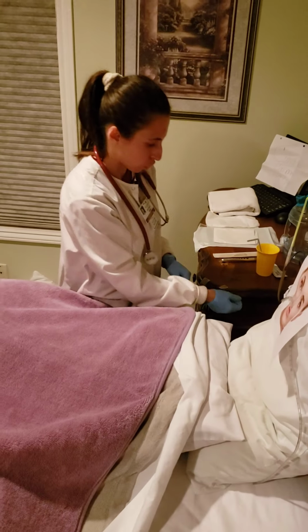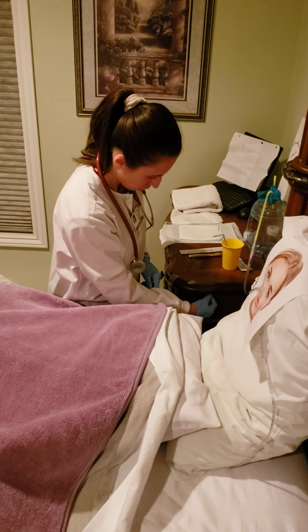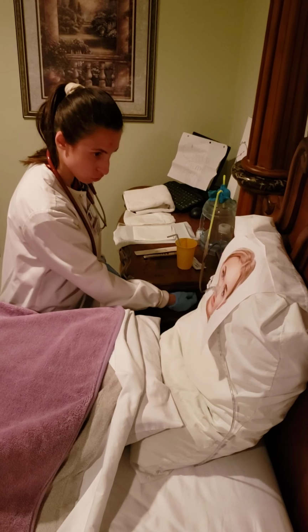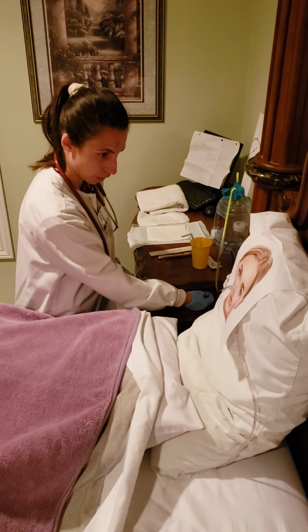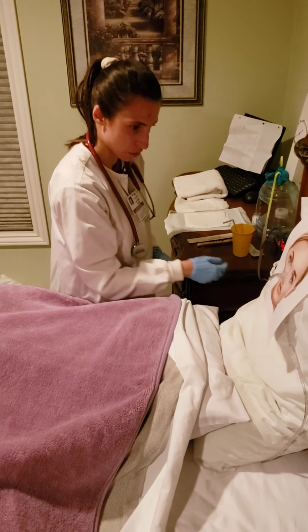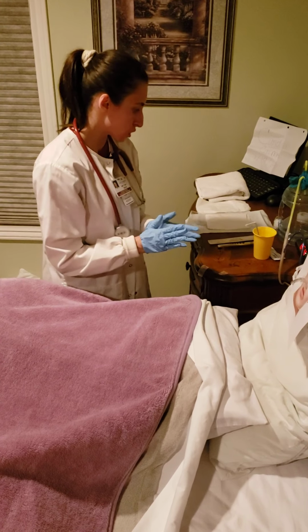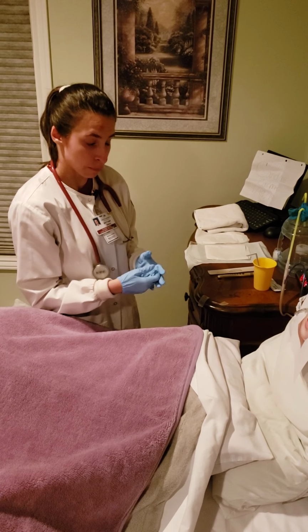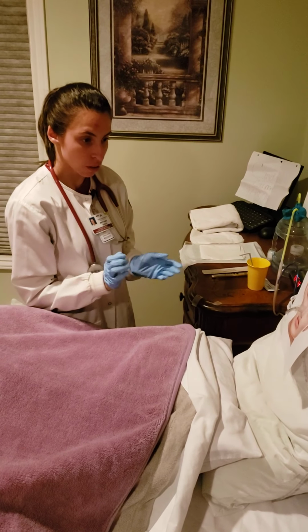Okay, Miss Carmel, I'm going to lower your bed down all the way to the lowest point, and I'm also going to lower the head of the bed, okay? Let me know when you're comfortable. You're comfortable? All right, Miss Carmel. So that concludes the procedure, and I will be back to check on you in an hour.